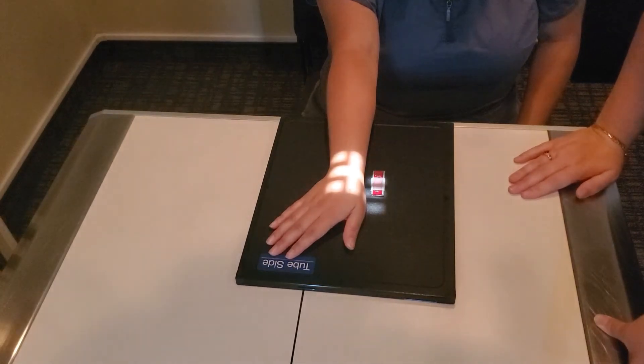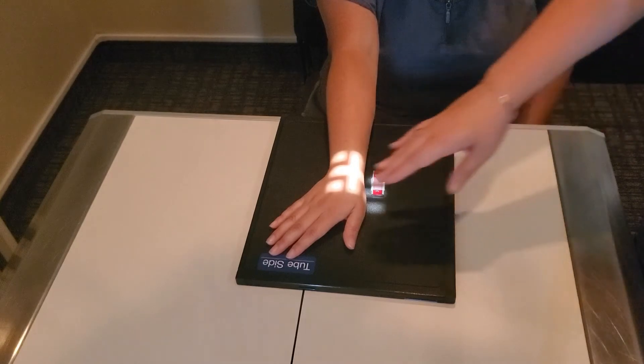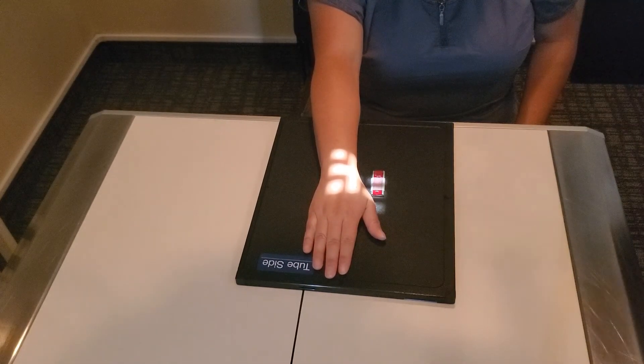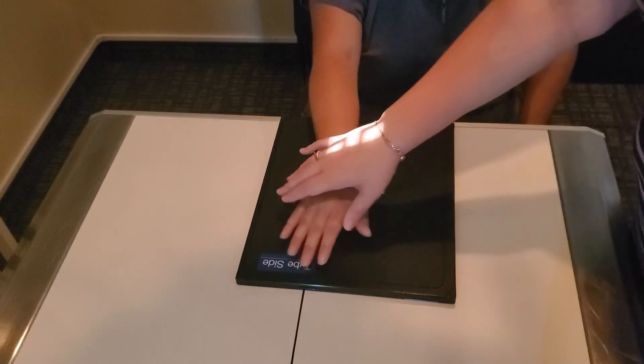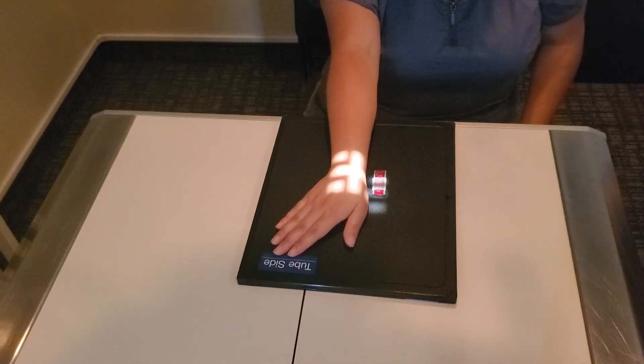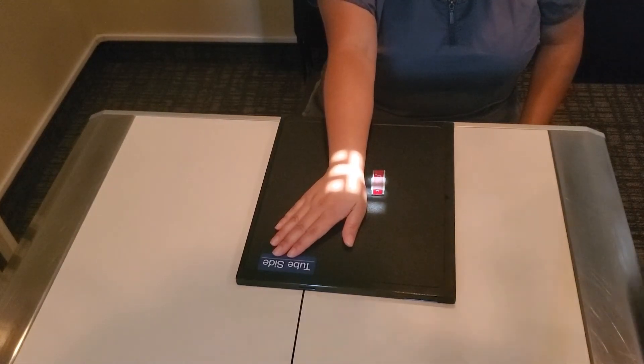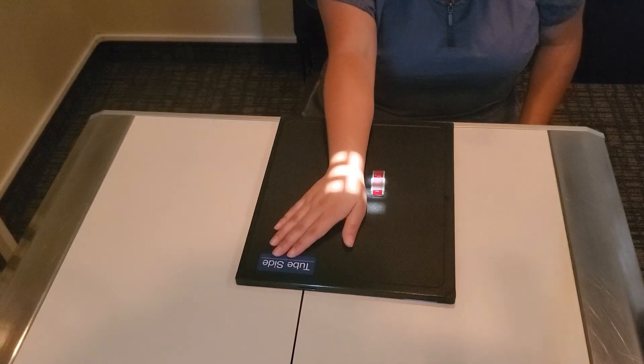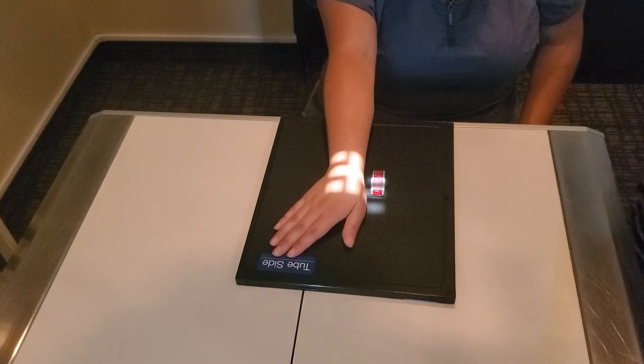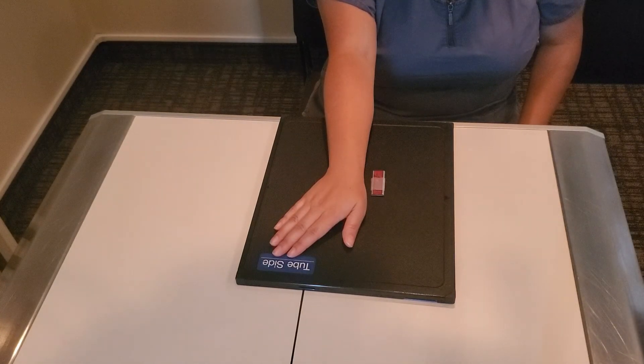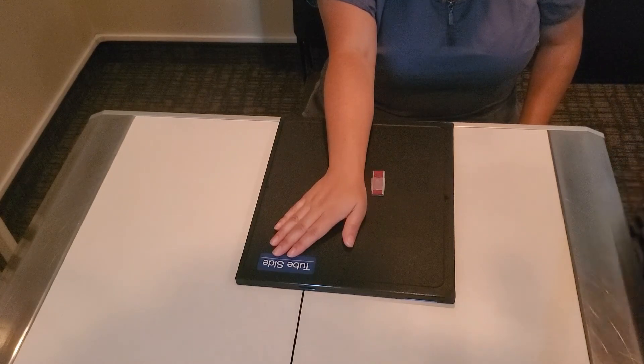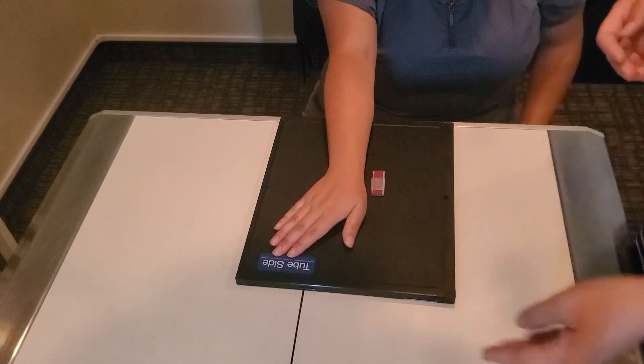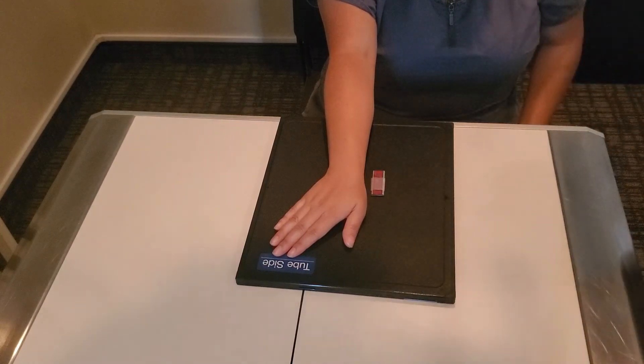The last projection in your Merrill's book it has your hand flat so it would have the hand just straight flat like that. We're not going to teach it that way. We're going to continue to be in ulnar deviation because this next picture is also for the scaphoid. And again pulling that into ulnar deviation gets those carpal bones away from the scaphoid. And this projection usually is done in a series often this is your Stecher method often done in a 0-20-40 series or a 0-15-30 series. We're going to do the 20 degree angle today because that's what we've always done so we're just going to practice that. So we're doing a 20 degree angle towards the patient's body.